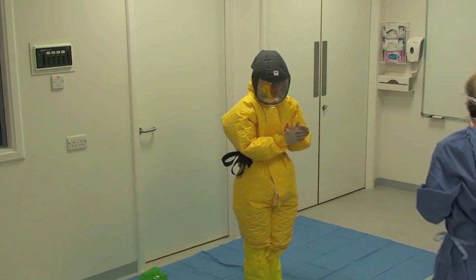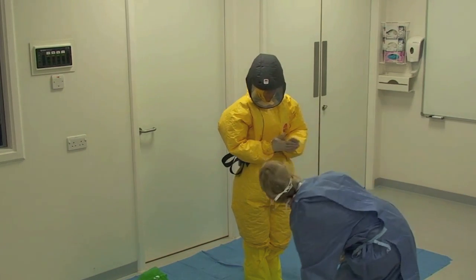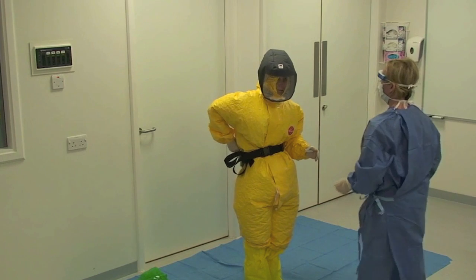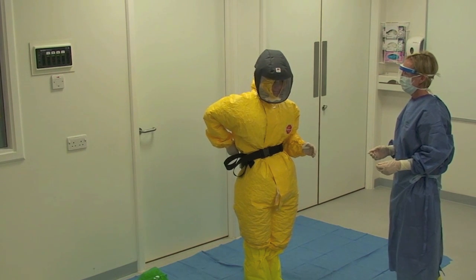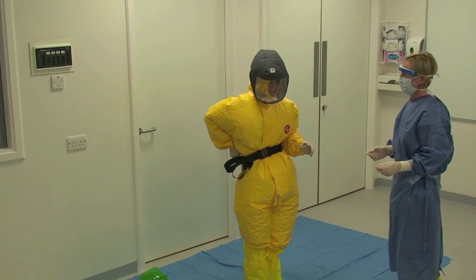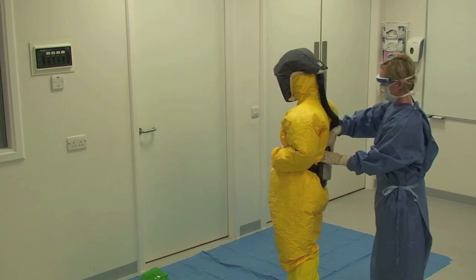The buddy applies alcohol based hand rub to the healthcare worker's gloved hands. The healthcare worker rubs this into their gloves. The buddy then switches off the battery pack and disconnects the air fed hood.